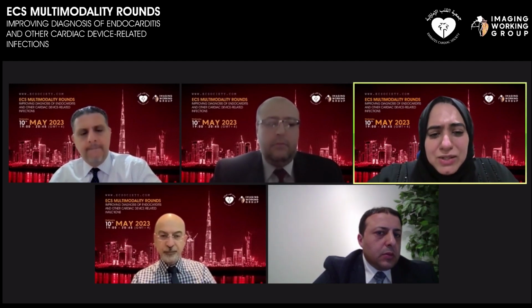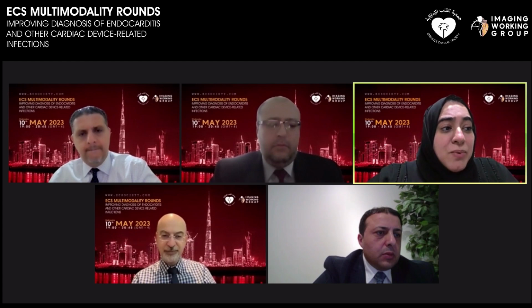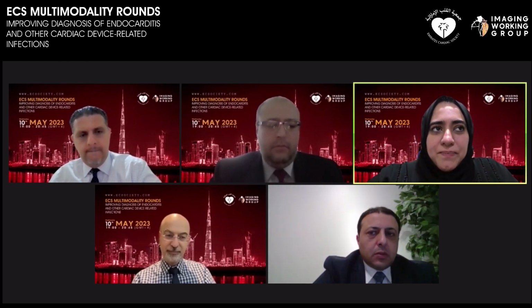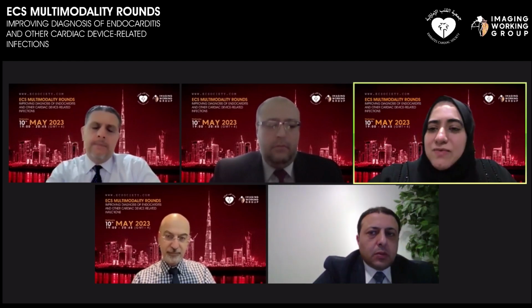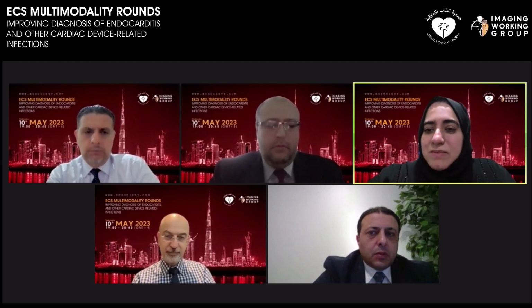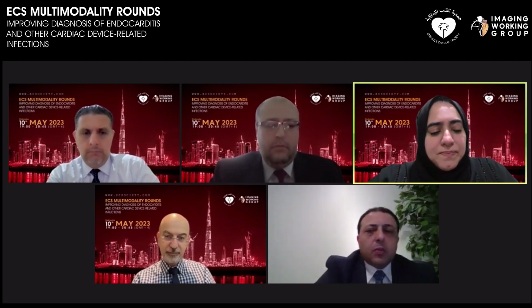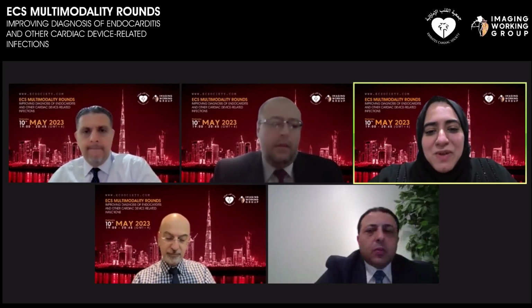I think Dr. Khalil will agree with me. It's very important, as Dr. Khalil mentioned, not to rely on just standard images. You need to try to take off-axis views. You need to go transgastric sometimes. I find for aortic valve, transgastric views are very helpful, also for mitral valve prosthetic endocarditis, because you can really go away from the glare from the prosthetic valve, and you can see really representative images of what's happening with the patient.